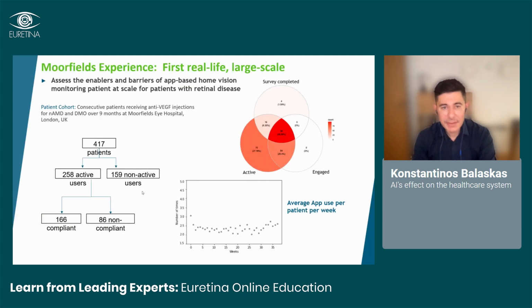And our emphasis was on understanding usability, how many of our patients can use these digital technologies, and how we can avoid the risk of excluding some patients from benefiting from this digital revolution, while our intention is, of course, to expand access to care.